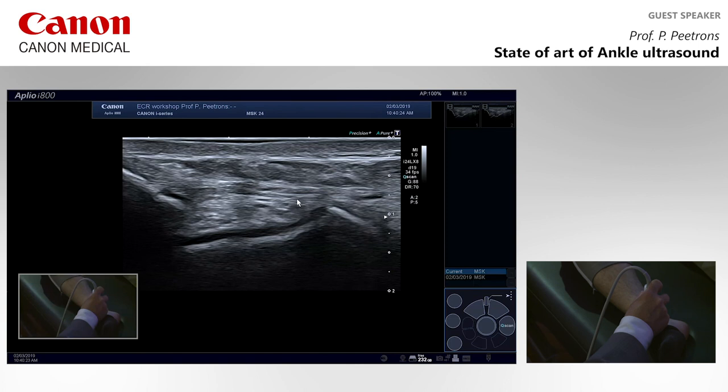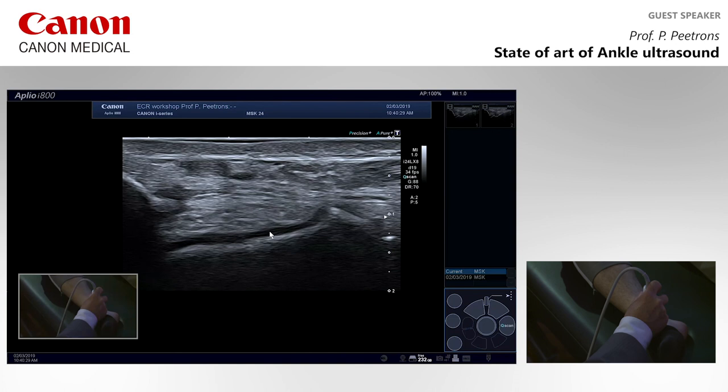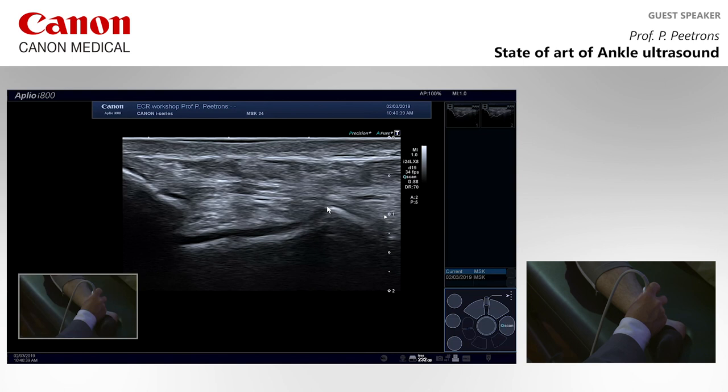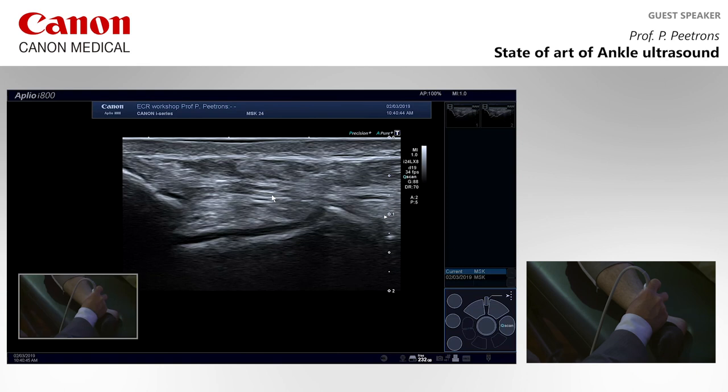You know that this is the cartilage of the talus, okay? Everybody knows that. There is no ligament inserting on cartilage, okay? So you don't have to look here. You have to look just after the end of the cartilage. It's always there that a ligament is going. So this is the little anterior part of the deltoid ligament. It is inserting on the beak of the talus just after the cartilage, okay?